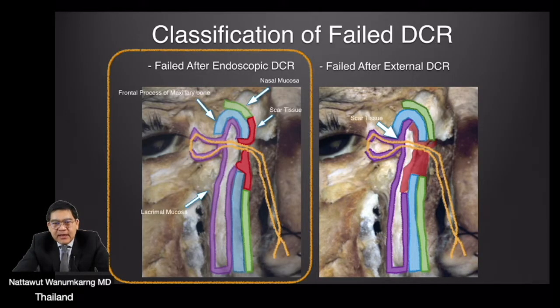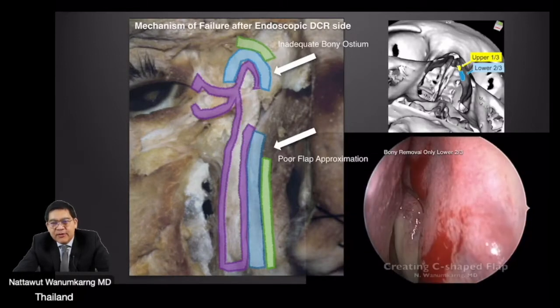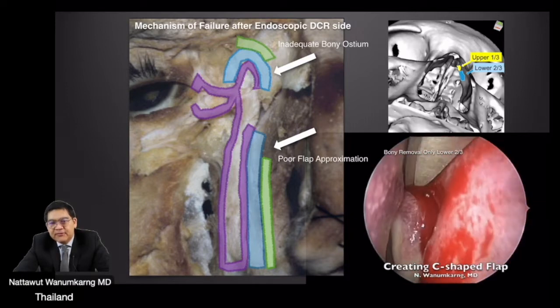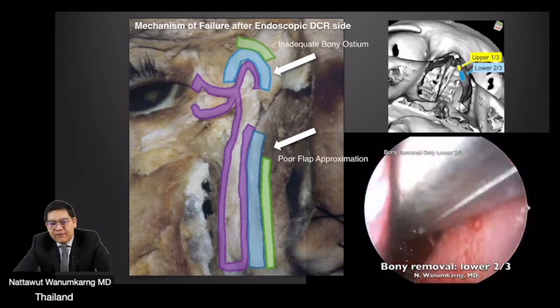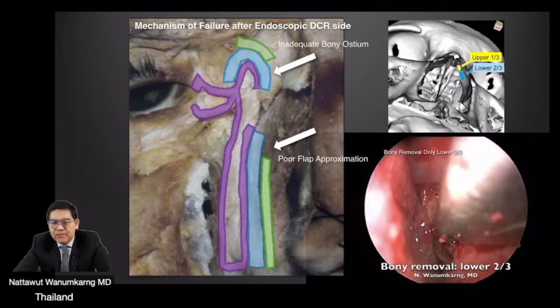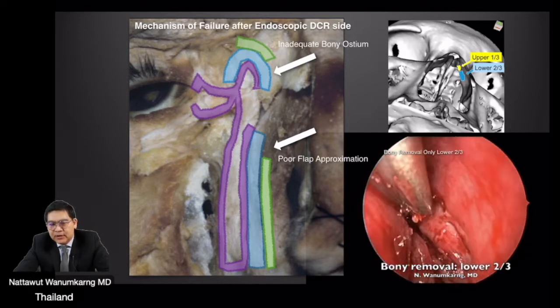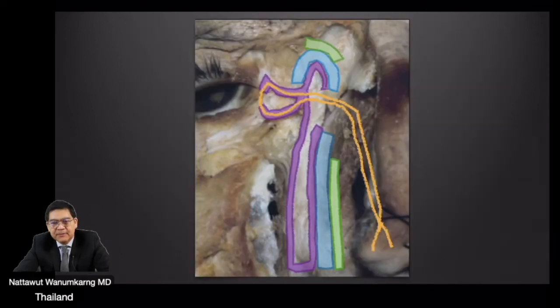First, the findings after endoscopic DCR. The mechanism of failure after endoscopic DCR is mostly inadequate bony ostium removal and poor flap approximation. In the video, the surgeon removes the bone only from the lower two-thirds, but not the upper one-third, and sometimes removes too much of the nasal mucosa.